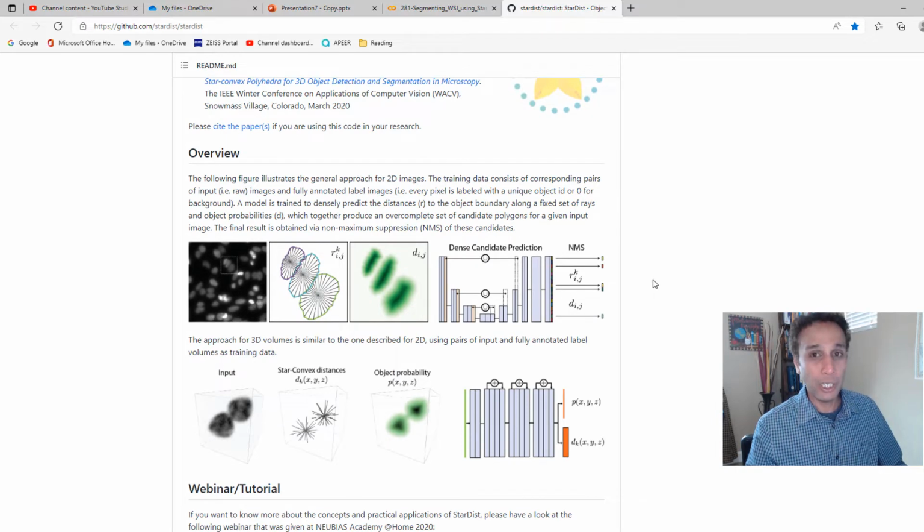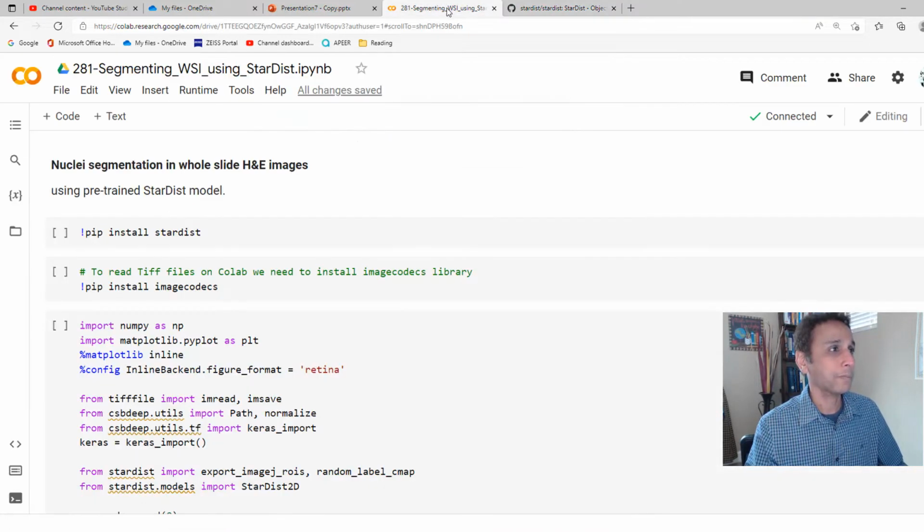And again, it uses a backbone model. It can be U-Net. By default, I believe it is U-Net, and it will be training a U-Net model. But instead of predicting the masks, or segmented image, it's actually predicting these two right there. It's a different approach. Go ahead and read the paper. Very interesting read. So let's go ahead and jump into the code.